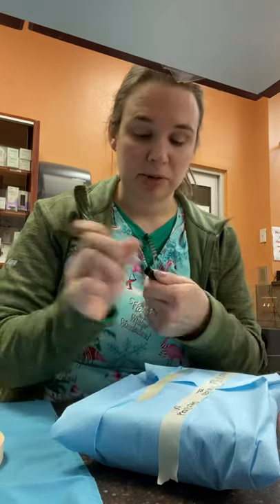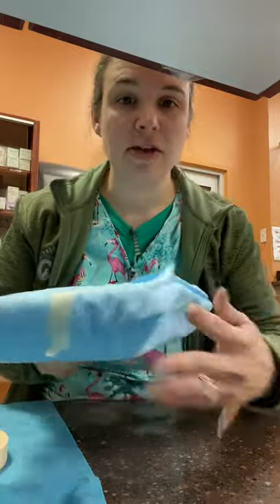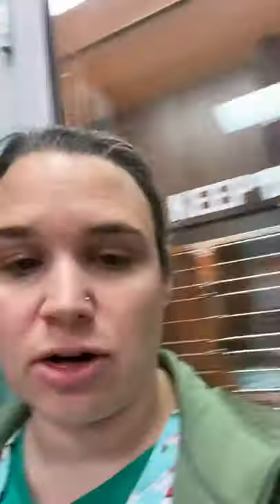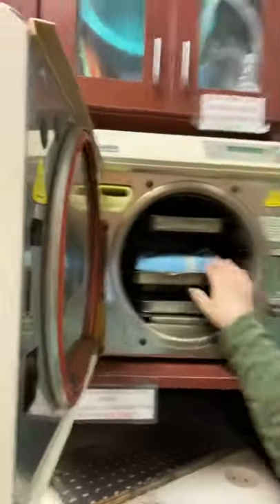That way it can be stamped with the date that it was finished sterilizing. Then, prepping for our autoclave, we take it over to the autoclave in the clinic. We make sure there is enough distilled water, which we do have by our indicator here, and then we place it in the center with nothing around it in the autoclave.